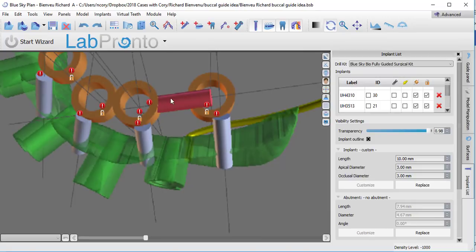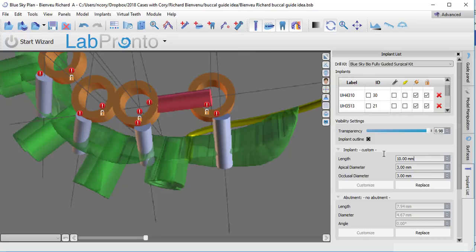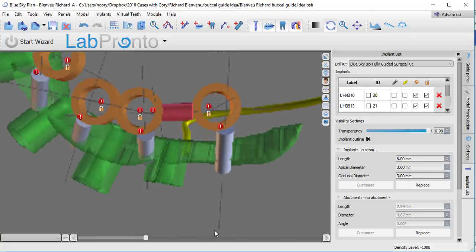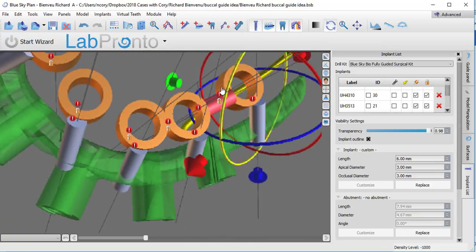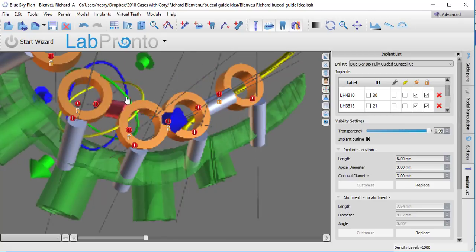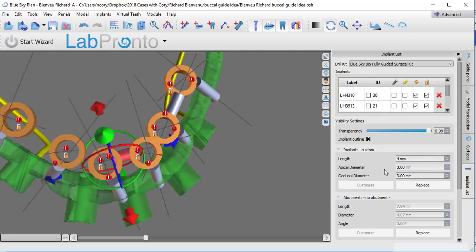Now here is where the length becomes a bit more of an issue. If I'm in my implant list and I've clicked on this implant, I can change the length of the implant, and let's change it down to about 6 millimeters because we obviously don't want to impinge into the internal of our guide tubes. So now you can see this is shorter. I can pull it to where it's just connecting. Now let's duplicate that. We'll shorten it again, this time maybe 4 millimeters. Just want it long enough to connect without impinging into the internal. So I need to go even smaller.